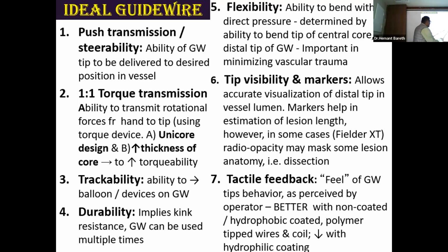And then there is something called tactile feedback. In PCI, everything you are dependent on your eyes. So your vision is being used for PCI. But for good PCI operators, there is also something called the touch sensation, how the tip is behaving, if you can experience that feel. If you push, then you feel the resistance.